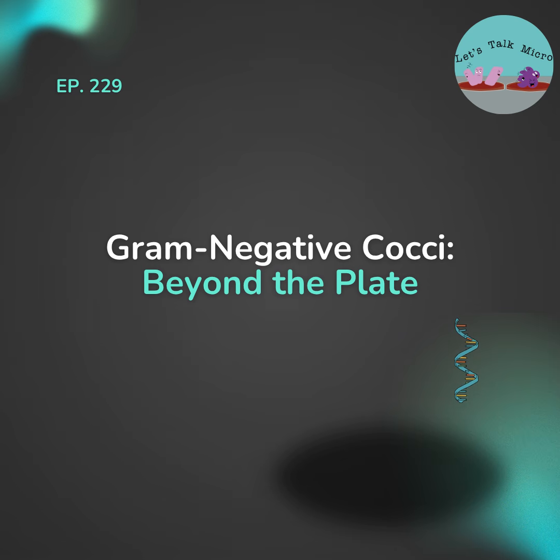Okay, so let's go ahead and do a quick recap. When we want to identify gram-negative cocci grown in culture, you have things like VITEK and RapID NH, and MALDI-TOF, which I know we have been focusing on for Neisseria and Moraxella. But with MALDI-TOF, you can identify Veillonella also.